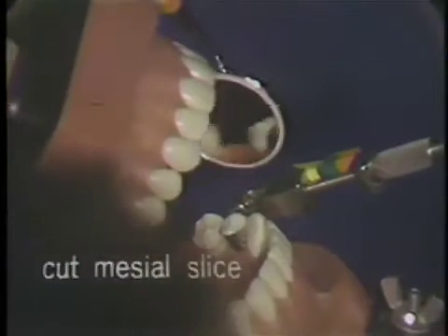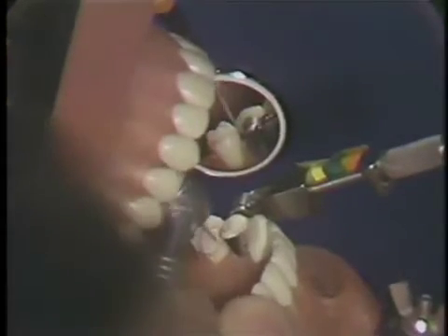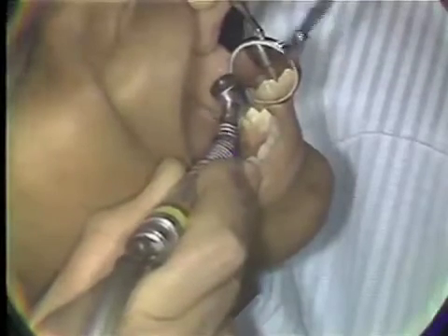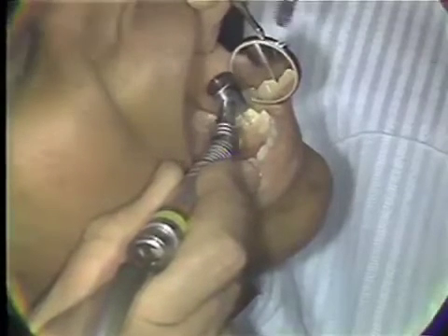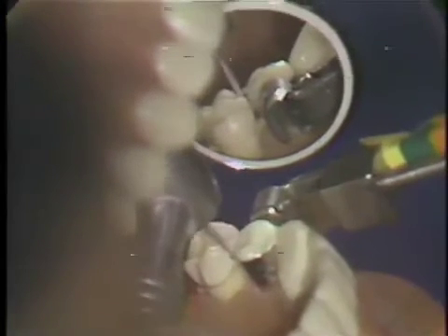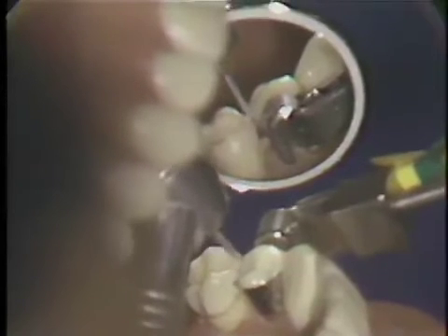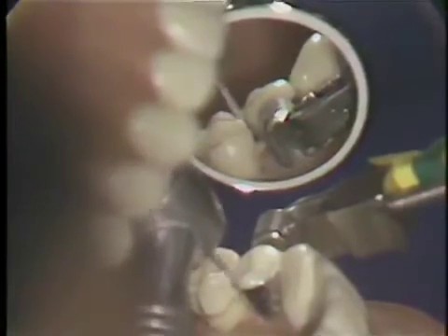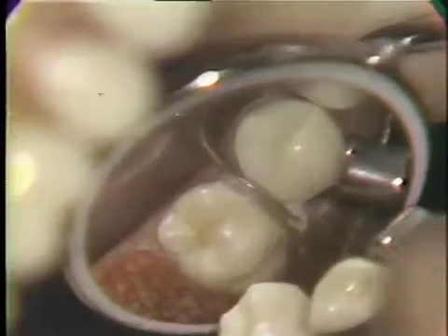The mesial is sliced utilizing a long tapered diamond from the seven o'clock position. The diamond is very carefully passed through the mesial surface, taking care not to cut the adjacent band or tooth. It is brought just through the contact area, taking care not to over taper or make this area of slice too open. From the occlusal view, you'll note the amount of opening that has been obtained with this diamond.